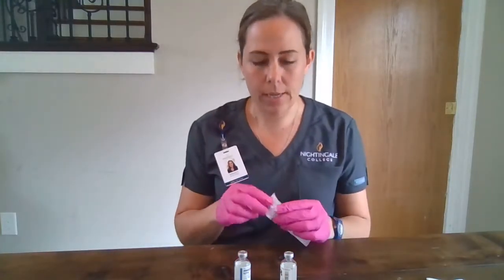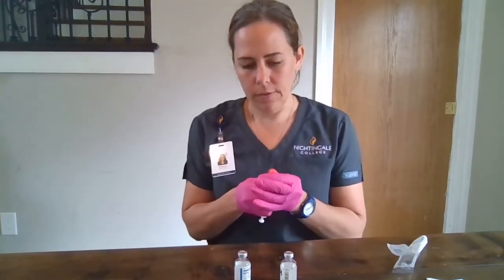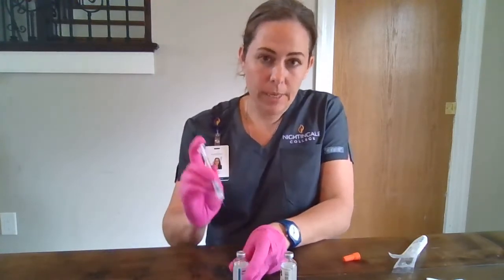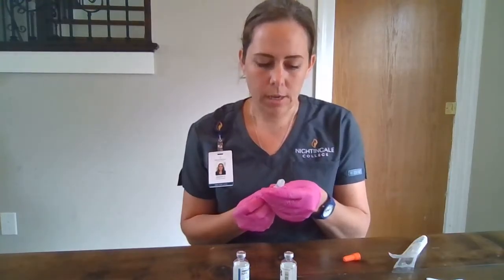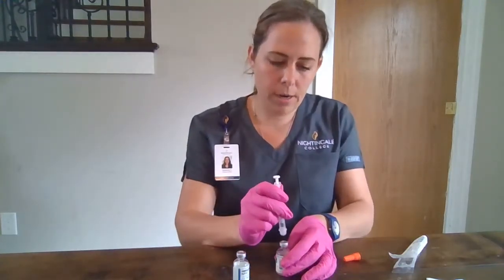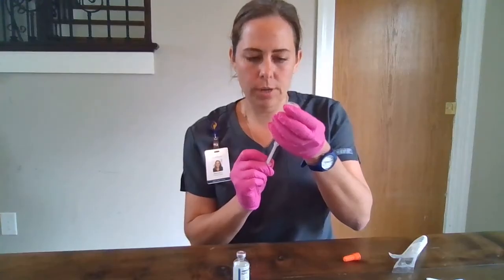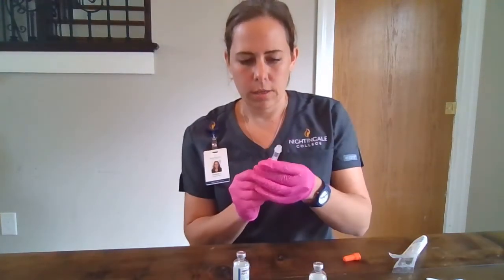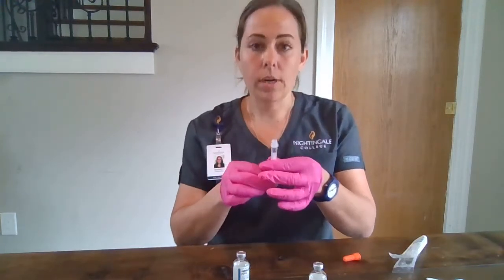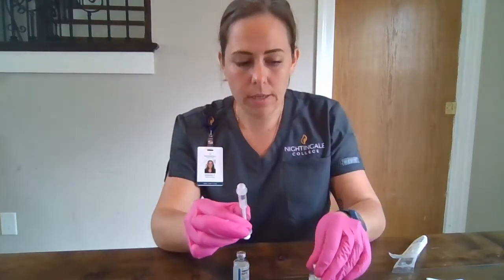We have our one ml insulin syringe. We are going to withdraw eight units of air and carefully uncap. We're going to inject those eight units into our NPH, making sure not to touch the medication in there and not withdraw anything at this time. Then we're going to pull up four units of air, inject that into our regular insulin, and then withdraw four units of regular insulin. We're going to tap any air bubbles out. Verify four units of regular insulin in our MAR, verify that in our syringe, and verify that we pulled it from the regular insulin bottle.